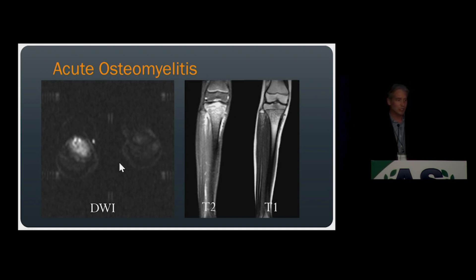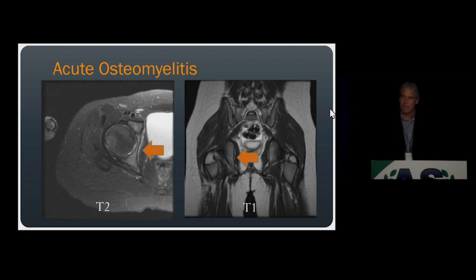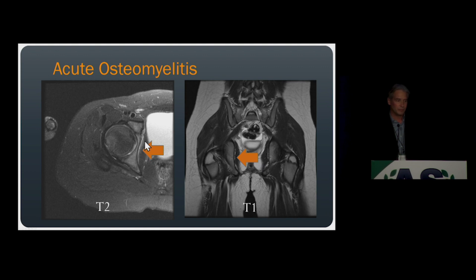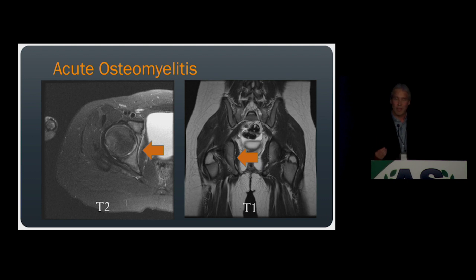Here's the same patient with a diffusion-weighted image showing increased signal representing restricted diffusion within the proximal tibia, consistent with hematogenous osteomyelitis. In this patient, DWI isn't particularly helpful because the findings were obvious on T2 and T1. However, consider a pediatric patient presenting with right hip pain, fever, and elevated inflammatory markers, with concern for right hip septic arthritis and osteomyelitis. On MRI, we see subtle periosteal reaction along the medial acetabulum, but the marrow is uniformly normal in signal on both T2 and T1. In this pediatric patient, diffusely uniform increased T2 signal is due to exuberant residual red marrow, which often makes it difficult to diagnose hematogenous osteomyelitis.